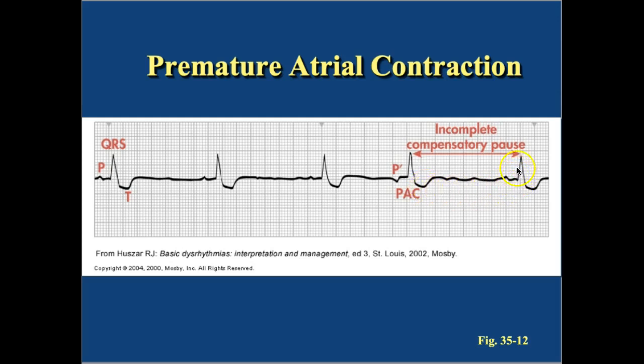This isn't quite a complete pause. Usually when you have PACs, your next beat will hit exactly where it should have had this beat been normal. To me that looks almost like a complete compensatory pause, but I guess if I got my calipers out, it is slightly incomplete. But just know that this is a PAC. It's just occurring a little bit sooner. The beat's coming a little sooner and it looks different.